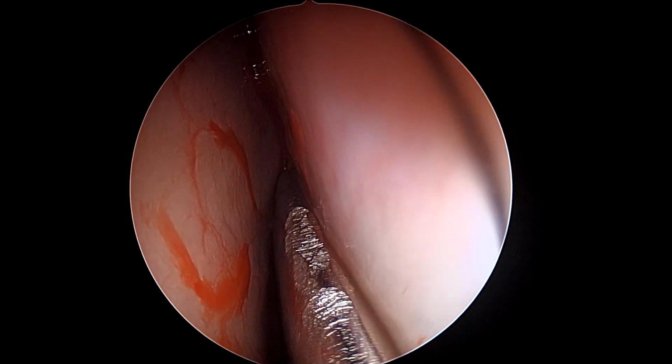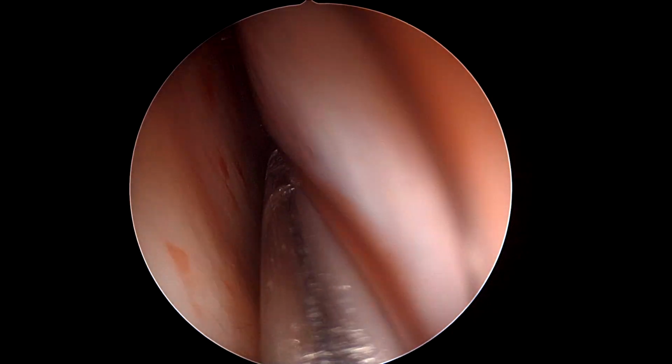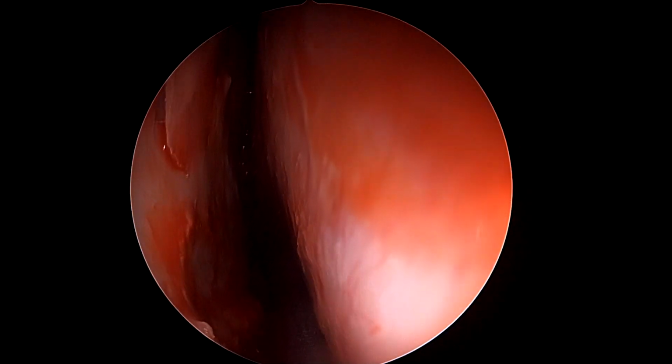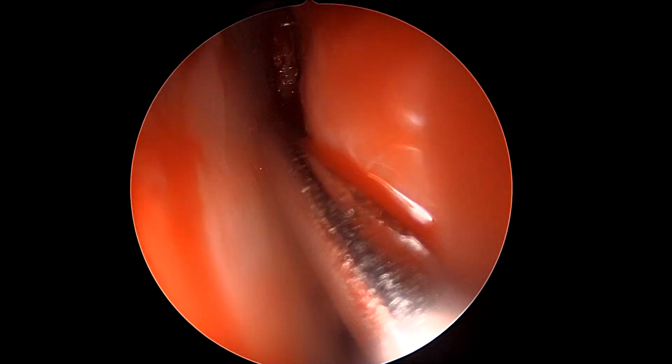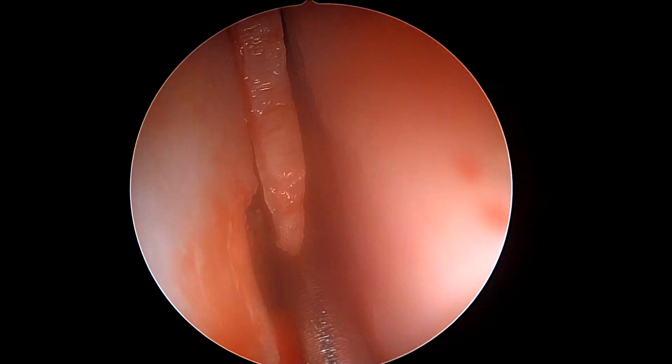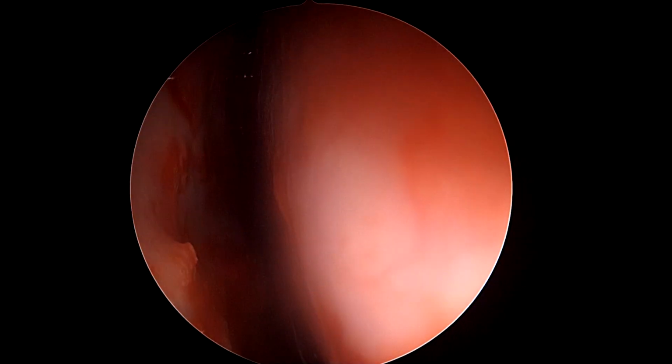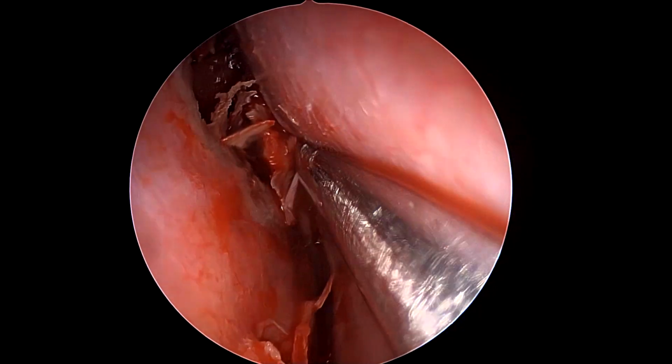In case of a large CSF leak, we can use it as a flap almost immediately, or we can just put it back and suture it like a septoplasty incision, thus avoiding any trauma on the lateral nasal wall, any synechiae formation, and it leads to a very, very fast recovery. So you see, we are in the septoplasty incision. We're using an endoscope for the septoplasty incision. If somebody wants to use a headlight, that is quite all right as well. Any approach is good as long as we understand what we are doing.